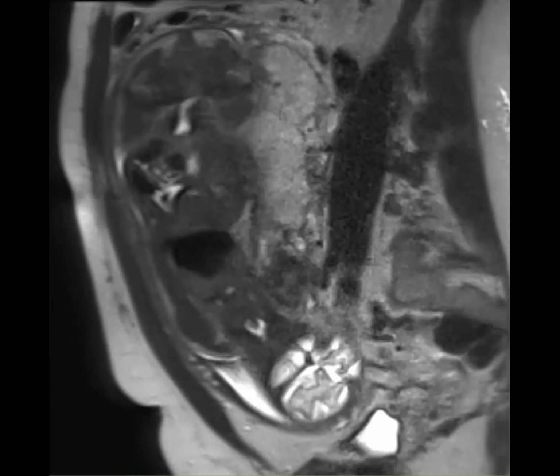Okay, that's it for me. Anyone else? Aarti, was that increta or accreta? Are we able to differentiate that? I think both accreta and increta are very difficult on MRI. I think percreta is the one you can be most definitive about.